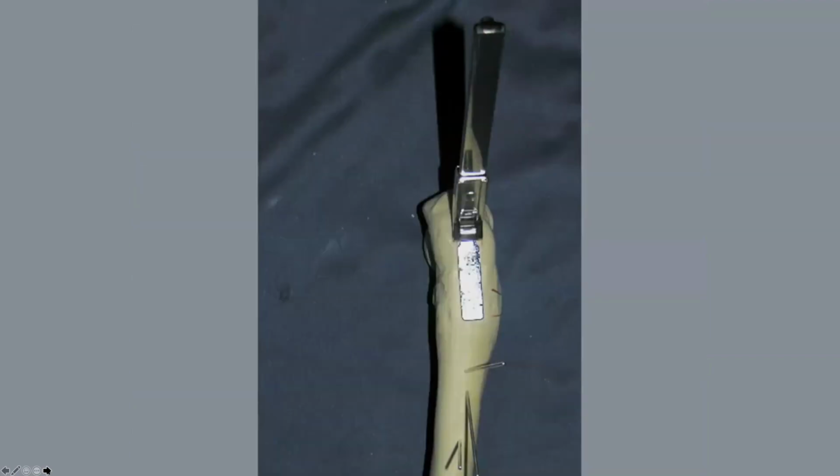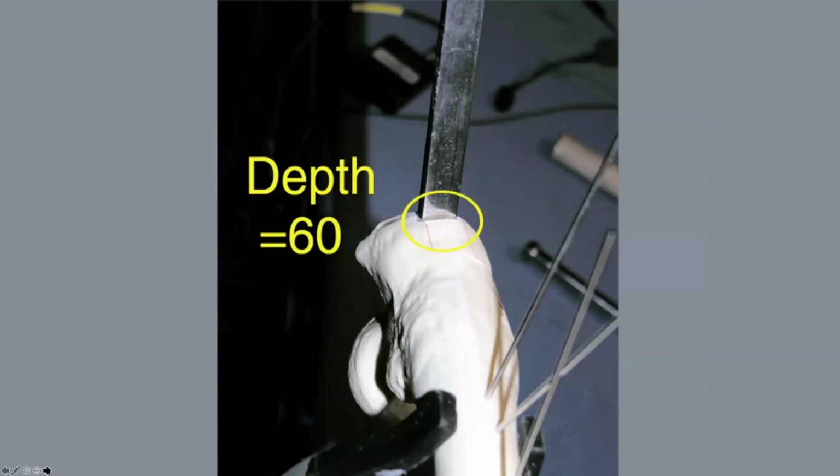Also look at it and think about the sagittal plane. So that's what this guide is for. It slides right over the blade plate seating chisel, and it tells you what your correction is in the sagittal plane. So make sure you use that. Put it on, take it off, put it on, take it off a number of times. Recheck yourself. Be very precise with this.